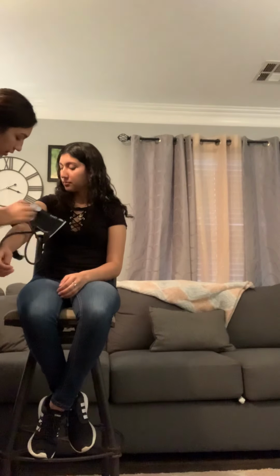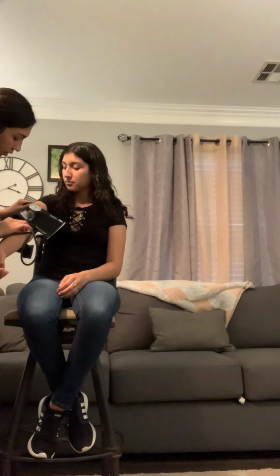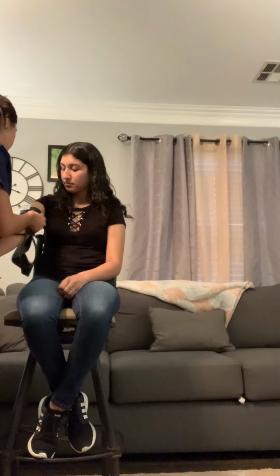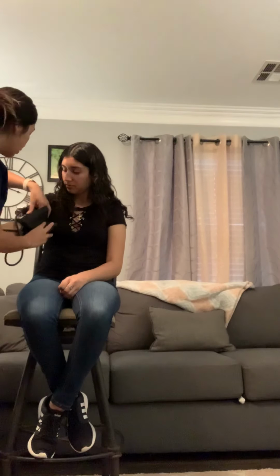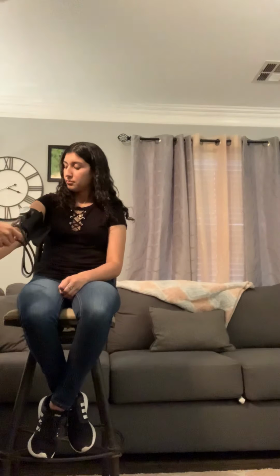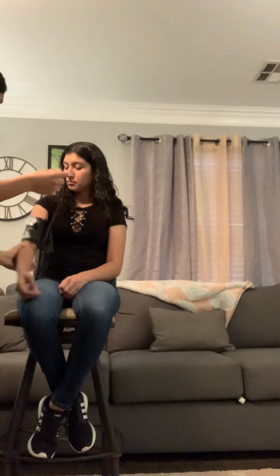If you had a gown on, I would be sure to expose the arm and then cover it again, for patient privacy. All right, let's do it auscultating. Again, I'm going to find your brachial artery and place the cuff 2 inches above that. I'll make sure the cuff is snug around your arm and completely deflated. You can rest your arm.